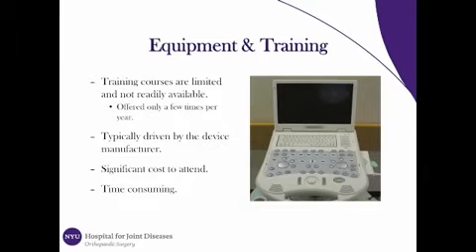Training courses are limited and not readily available. They're typically driven by the device manufacturer and offered only a few times per year. They can also be costly and time-consuming to attend.